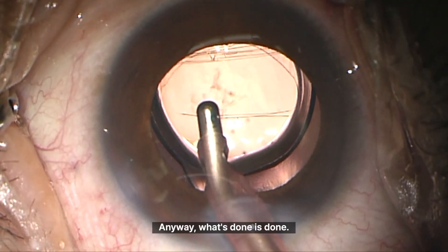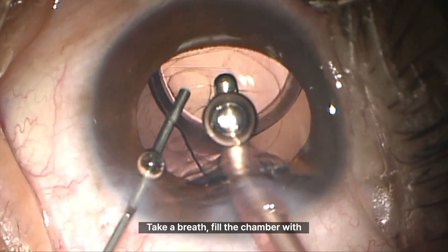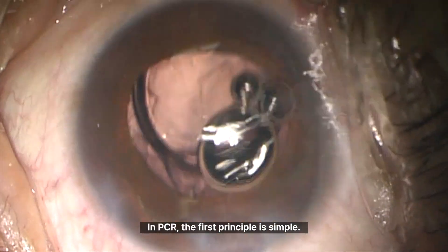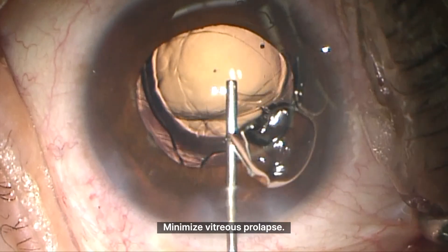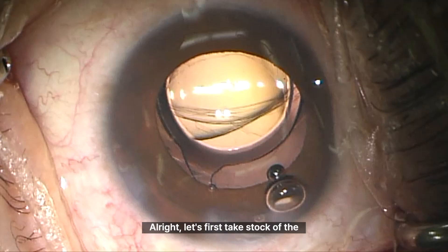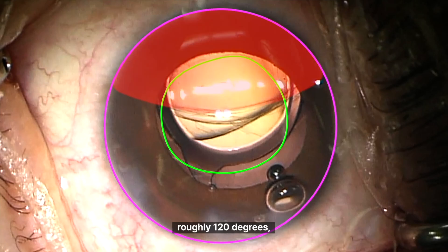What's done is done — now the only focus is solving the problem. Take a breath, fill the chamber with viscoelastic, carefully withdraw the I&A. In PCR, the first principle is simple: minimize vitreous prolapse. Let's take stock of the situation. The capsulorhexis is still intact, but from about 7 o'clock to 11 o'clock — roughly 120 degrees — there's no posterior capsule support. So with a one-piece IOL already sitting in the bag, what are the possible options?